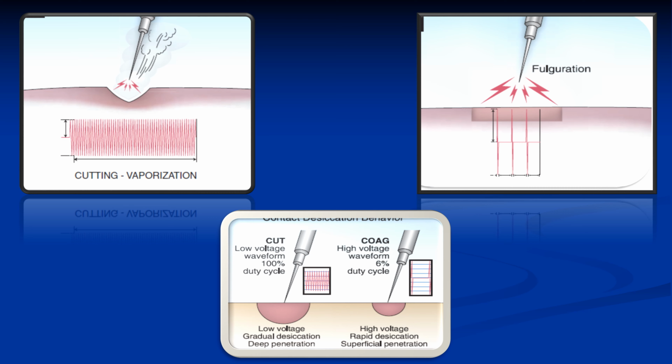Comparison between desiccation produced by coagulation mode and the cutting mode. Desiccation by cutting mode will be deeper. Using coagulation, it will be superficial desiccation.